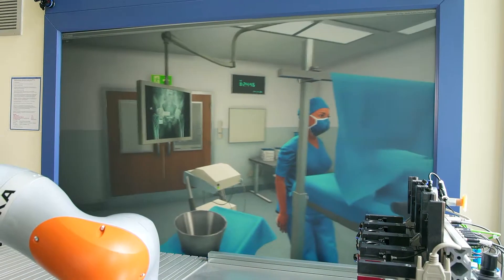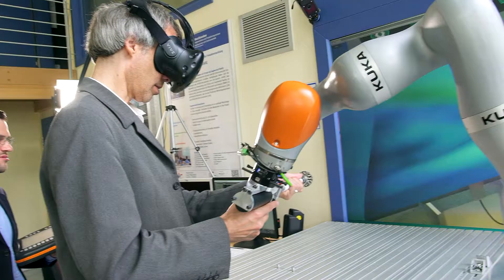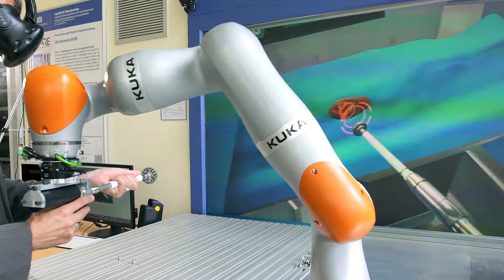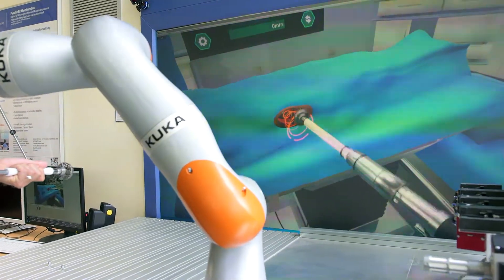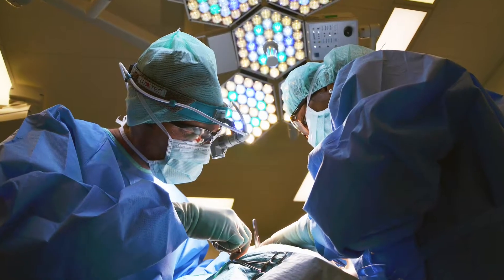Trying this step out, including haptic feedback before the actual operation, can be considered an important step during the planning phase before the actual intervention. And it can be a milestone during the training of surgery students.